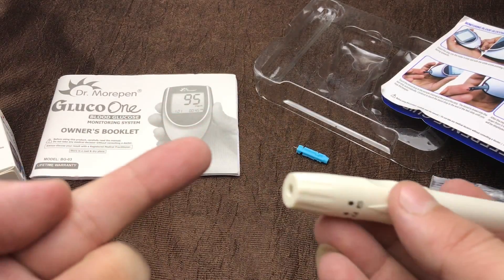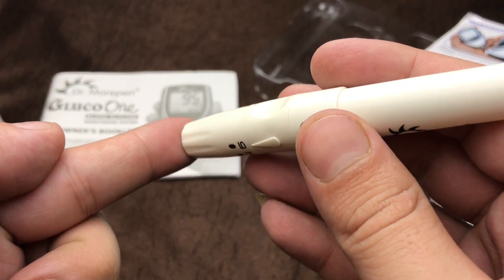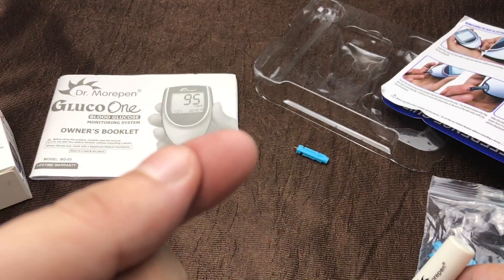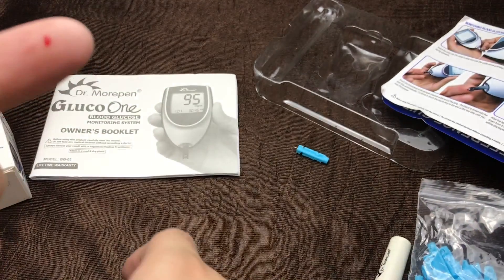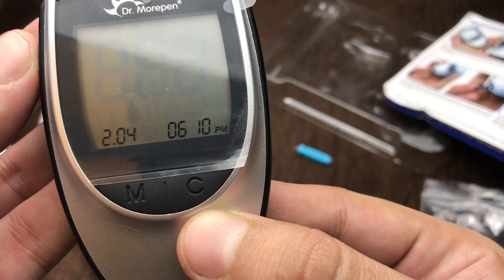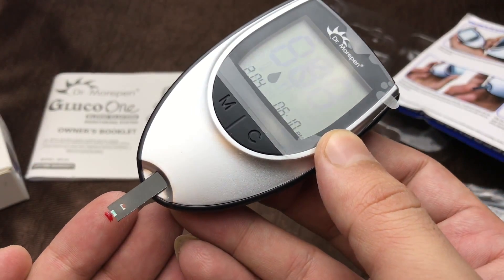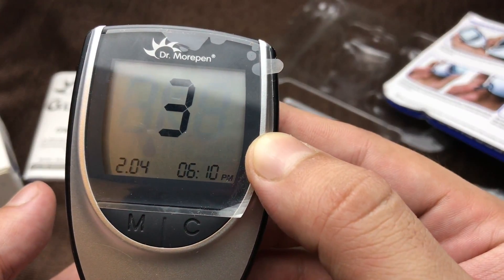Use any finger, put this pen like this and press the key like this. When you see the blood, put the bottom side on the blood like this, and after five seconds you will see the results.